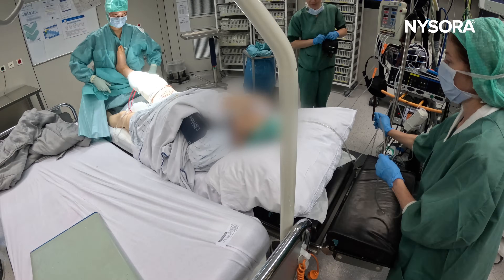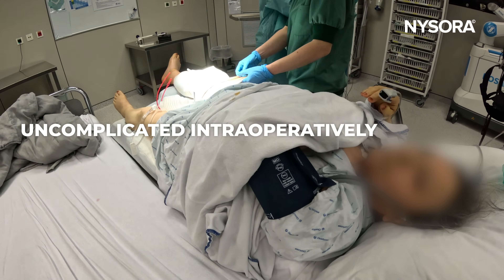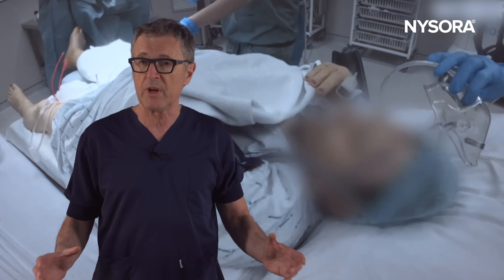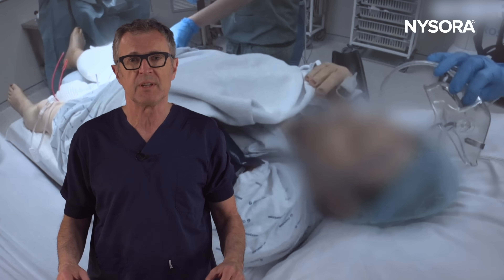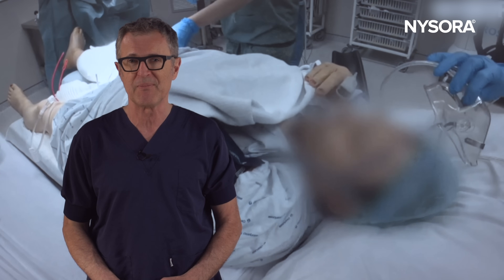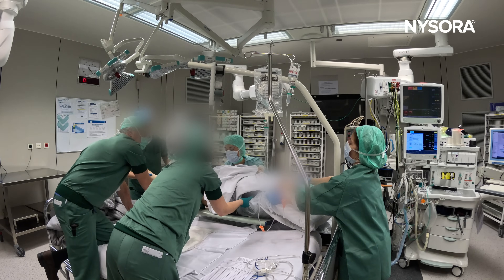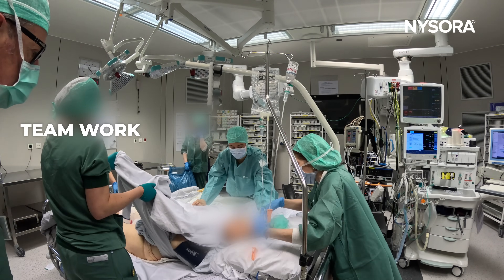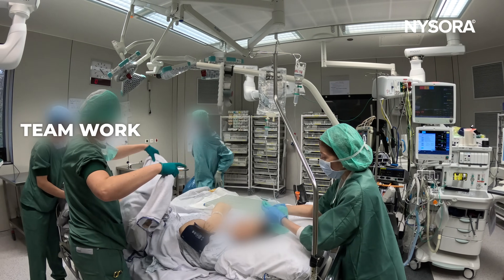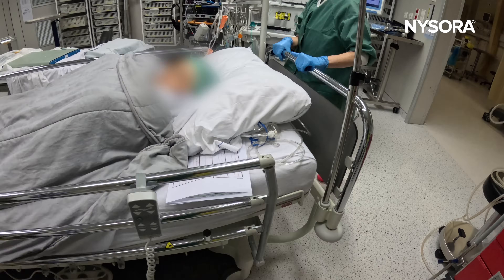The operation is all finished, and it's a totally different picture — comfortable patient, no pain whatsoever. As you can see, this technique results in remarkable hemodynamic stability, which is why we prefer spinal anesthesia in all patients that are ill, having lower extremity surgery, and do not have contraindications for spinal anesthesia. The patient is ready to be transferred to the recovery room. There's no waking up, no weaning off an anesthesia machine or ventilator — ready to go. Talk about time efficiency.